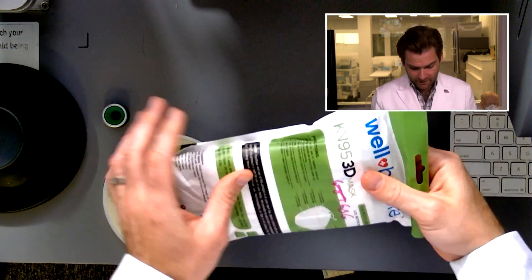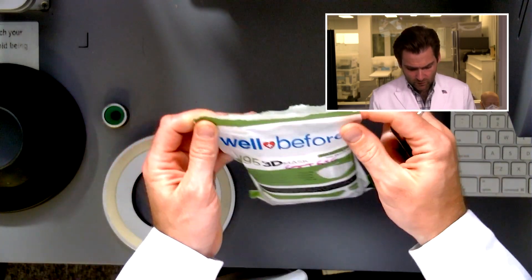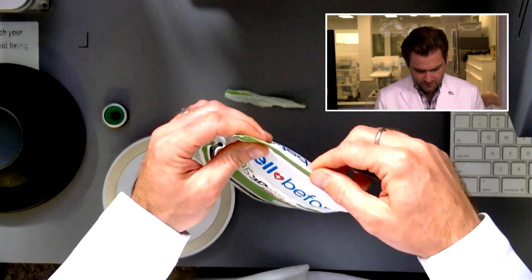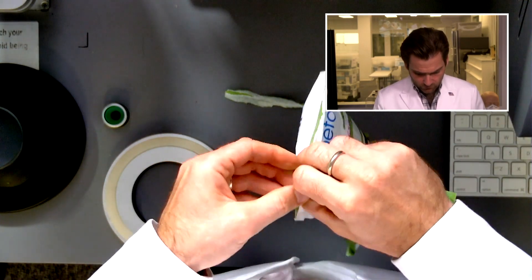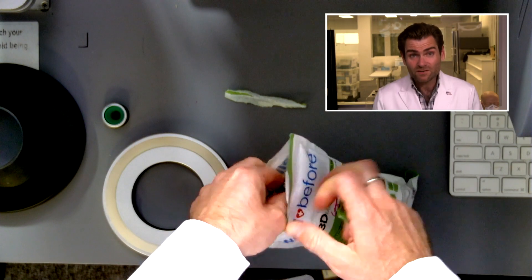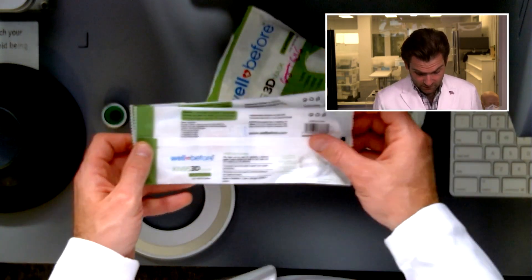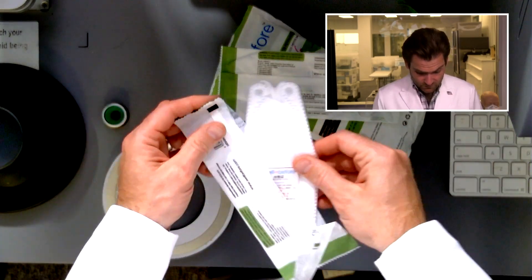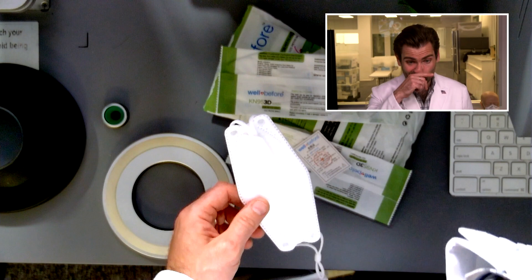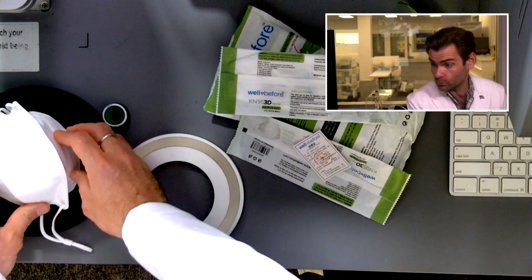I love the packaging — I've never really seen packaging quite like this. It feels substantial but also feels like it might be more affordable to make. Every single one of the Well Before masks is individually packaged, which is just insane. They're selling for $1.49 — you could not get that in the United States for that price. It would be impossible.